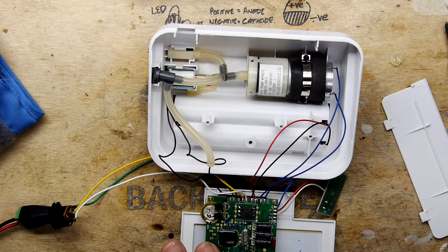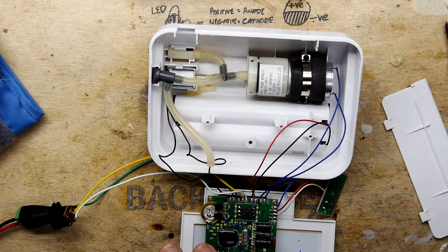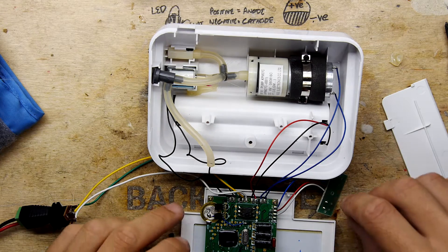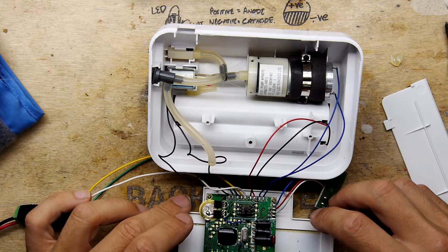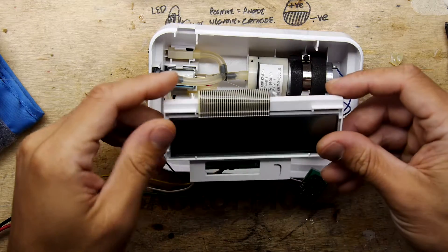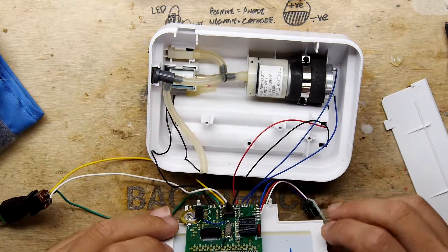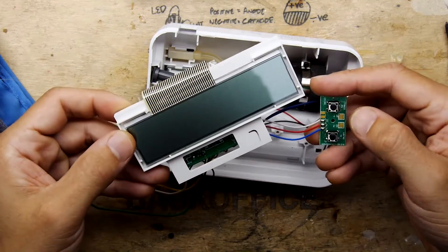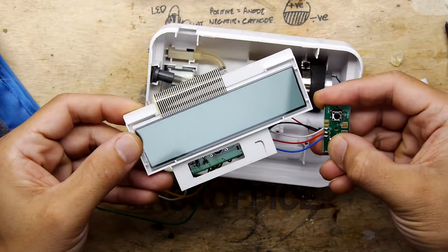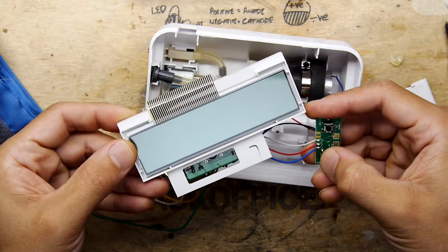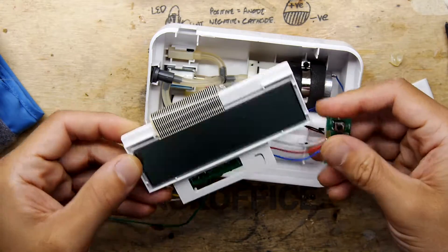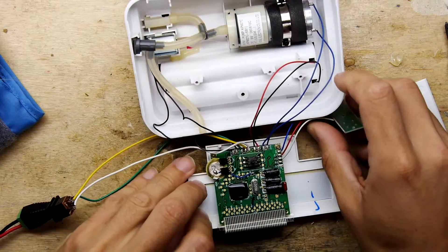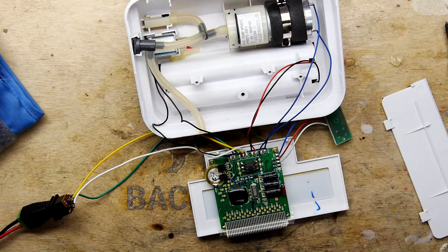And drawing currently no current. It says 22 milliamps. For me, that's just nothing. I don't think it's actually working. I'm going to hit the start on off. Dead. Dead as anything.